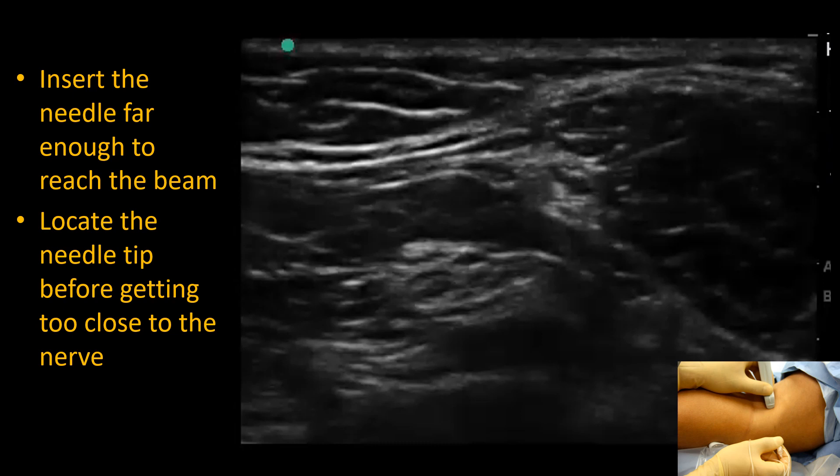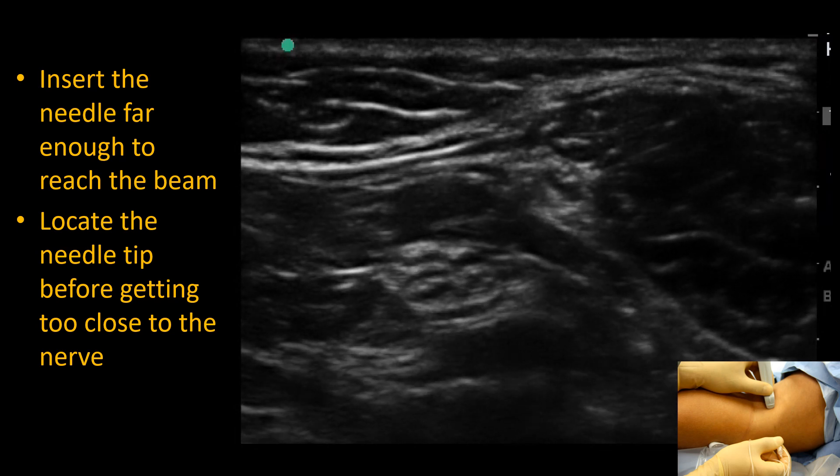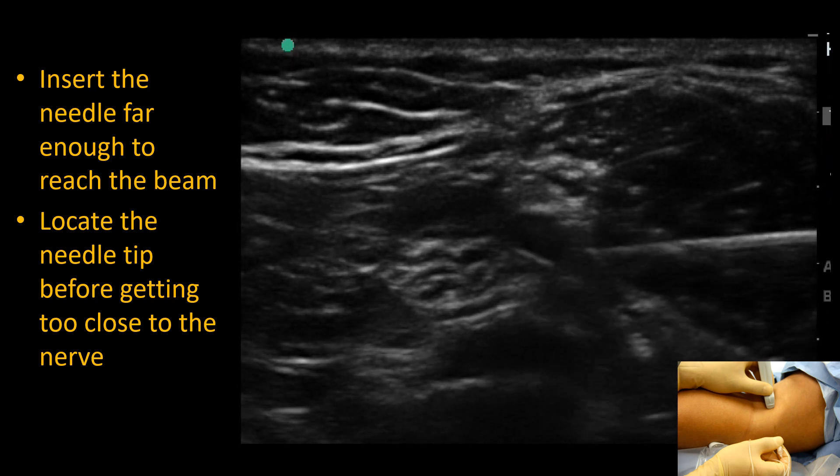The needle tip should be identified before getting too close to the nerve. Note however that the needle may have to be advanced a couple of centimeters before it appears within the field of the ultrasound beam. Make seesaw needle motions plus small sliding probe movements to achieve alignment.